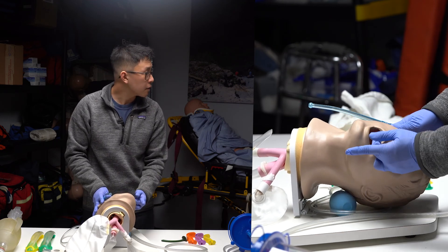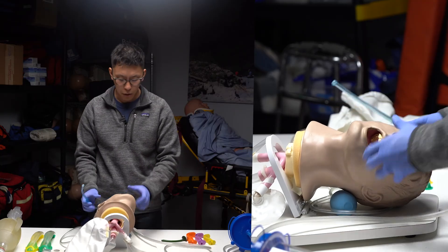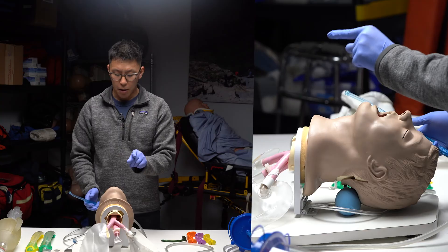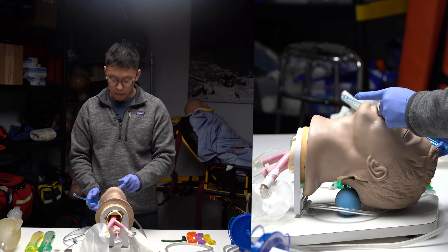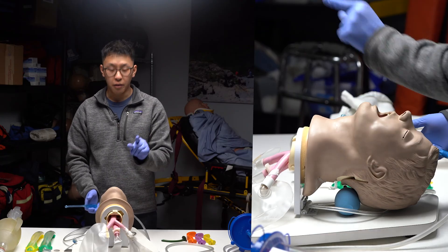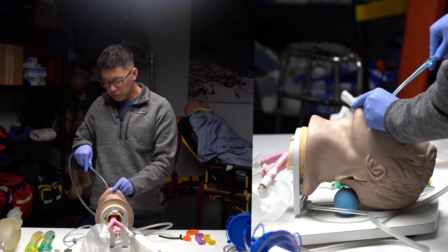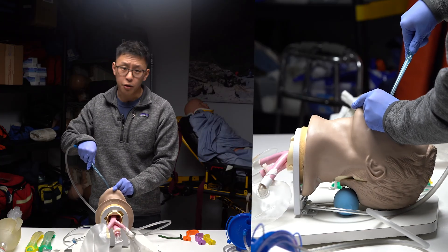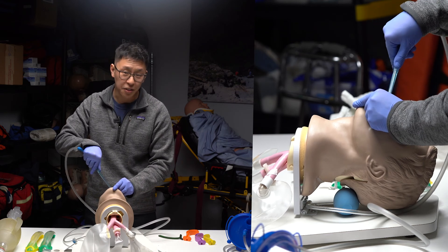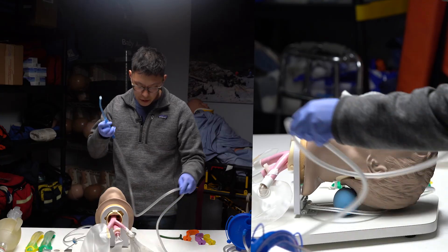We have to perform the scissor technique. On your non-dominant hand, at the end of a snapping motion, your thumb is on the right of your middle finger. Your middle finger sits on the top teeth and your thumb on the bottom teeth — then push to open the mouth. Go in with your thumb off the hole, find the secretions or follow the gum lines, occlude the hole, and suction for no longer than 15 seconds. Your proctor will say the airway is clear.